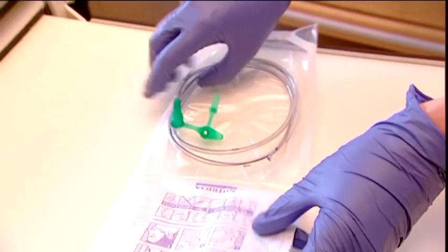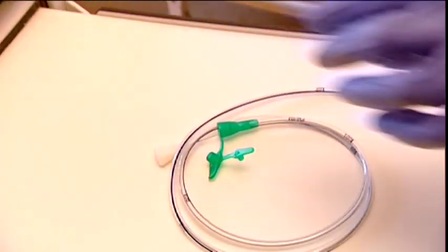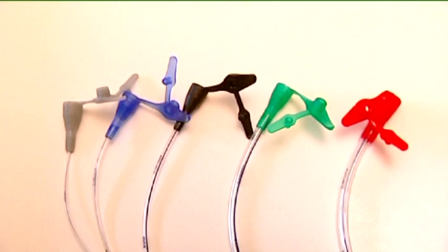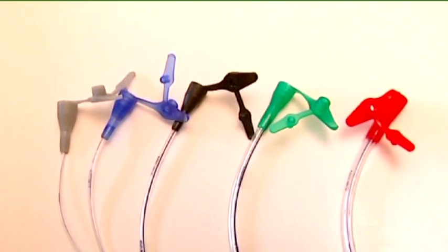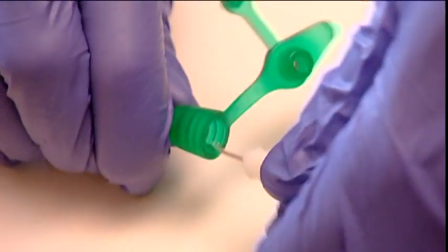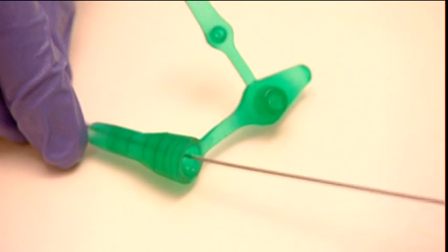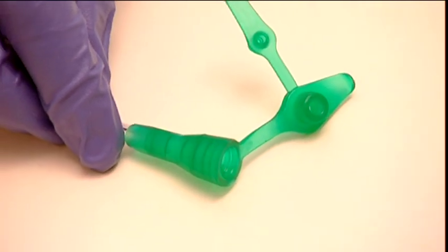Flocare Nasogastric Tubes are available in multiple lengths and charières, and are offered with or without guide wire. The tubes are available in PUR, silicone, and PVC design. PUR and silicone tubes are more patient-friendly than PVC tubes because of the softer materials used.